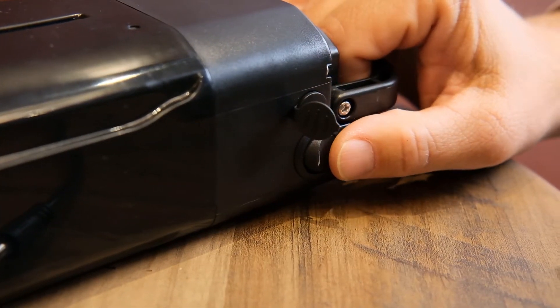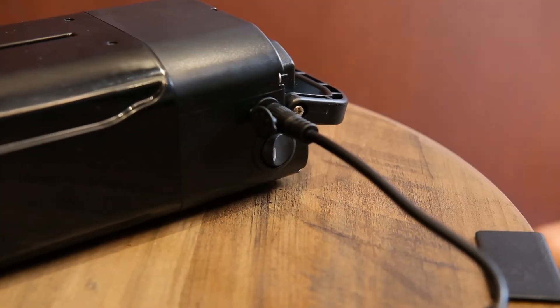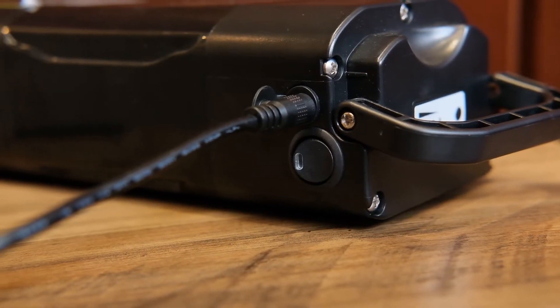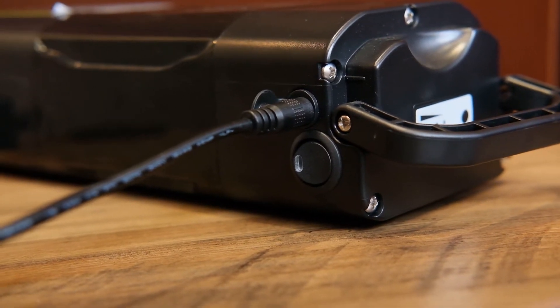To charge the battery, make sure the power is switched off and then plug the power adapter into the battery and the wall receptacle. If the receptacle needs to be switched on, make sure you do so. It takes three to four hours to reach a full charge. Once the battery is fully charged, the power adapter indicator light will turn green.